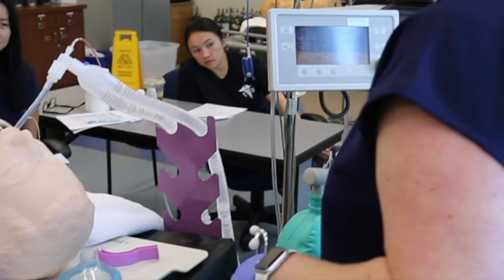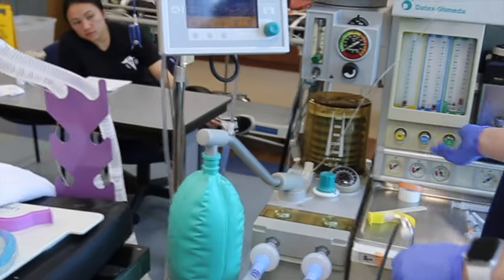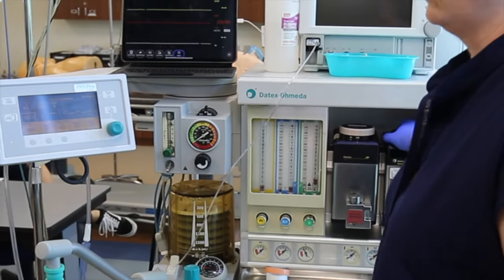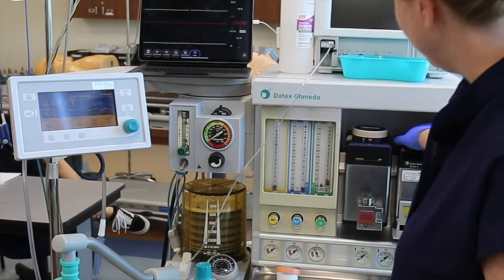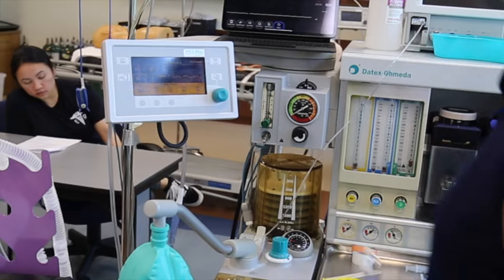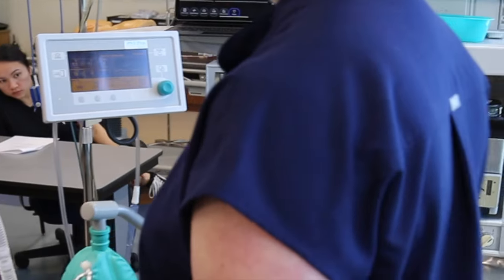I'm going to turn my vent on, open the APL, turn my flows down to 2 liters. If your machine had air, you could do 1 and 1. I'm going to turn your sevo on. I have it dialed into 3. Then I'm going to sweep back. Flows are low. APL's open.